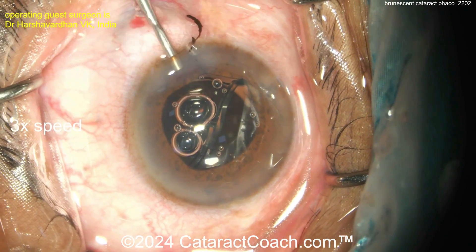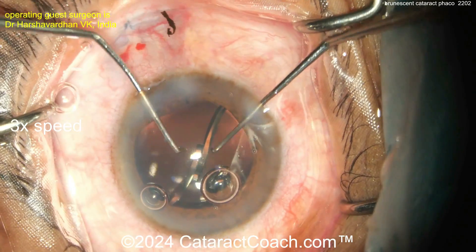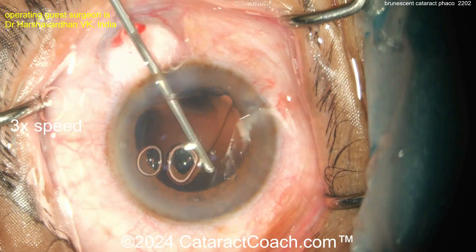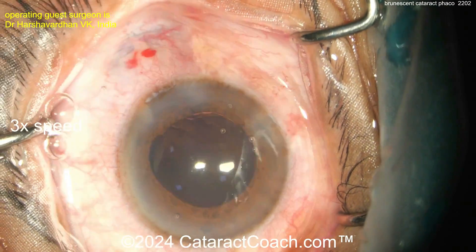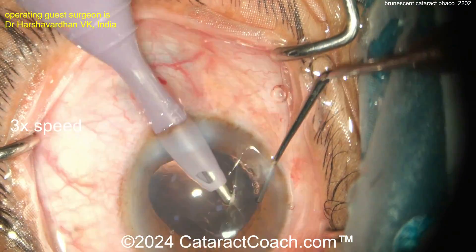Fix the pressure gradient — there you go. More viscoelastic to see what's going on. You've got kissing haptics — get those separated. Take the time to confirm that both haptics and the optic are completely in the capsular bag. That is a critically important step. Good job — remove the viscoelastic and call it a day.